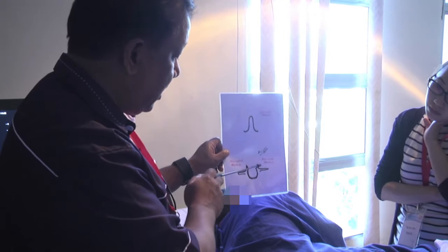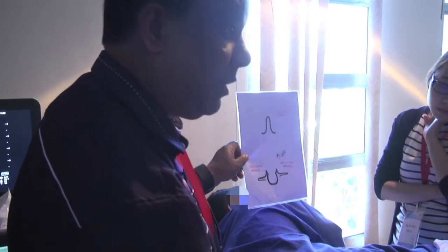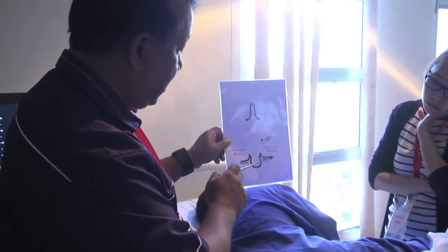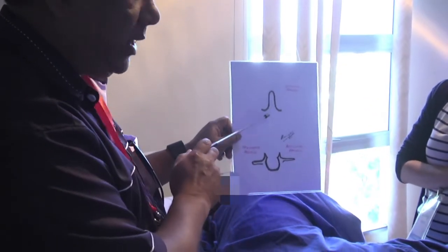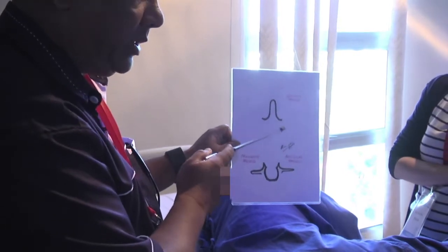You see, these are the articular processes. Can you see there? These are the articular processes in the lateral aspect. This is the spinal canal. These are the transverse processes laterally, see? Okay? So, while this can be very useful to locate the midline, if you can't palpate the spinous, it's very objective.